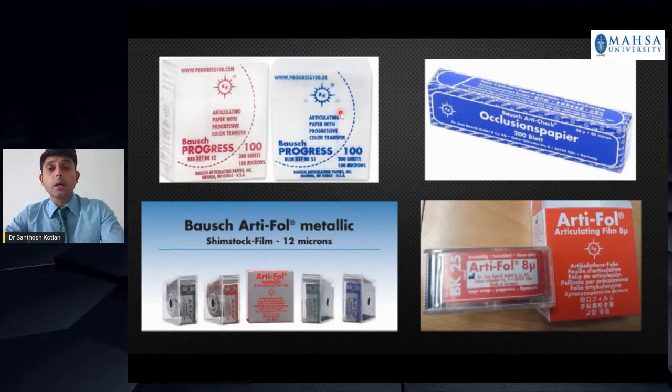But if you're checking for any interferences in natural teeth especially, you can use the 20 to 40 micron paper, because natural teeth always have some amount of micro movement in them because of the periodontal support and all that. So you can use them for crowns and bridges also, to check the high points.